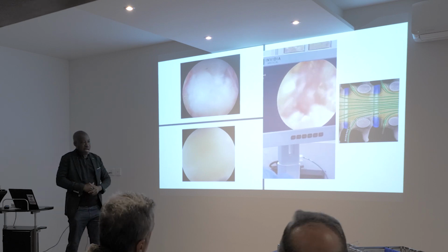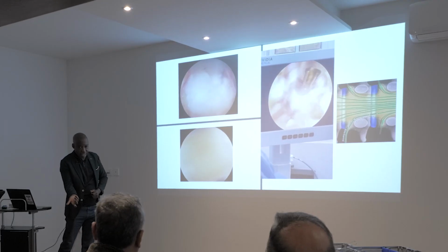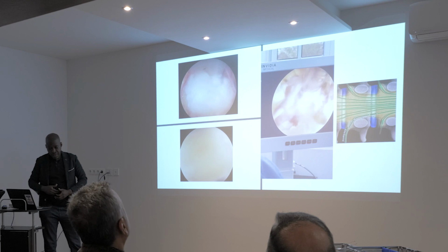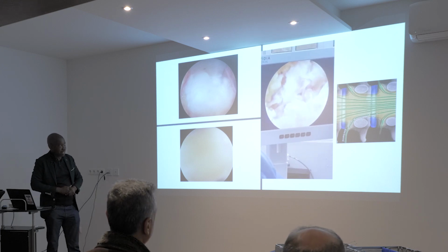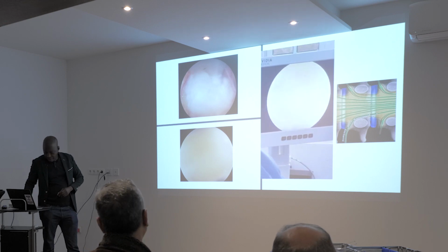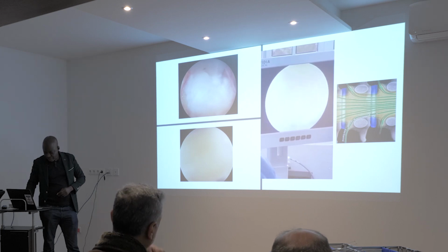One thing I do, I try to avoid using the sleeve to retract the nerve. I try as much as I can with the forceps to go into the lateral margin, mobilize it, go up, and then bring out the disc. I feel any retraction of the dura is a little traumatic, from my own understanding. So this is how it goes, a big herniation. I think we can skip it.